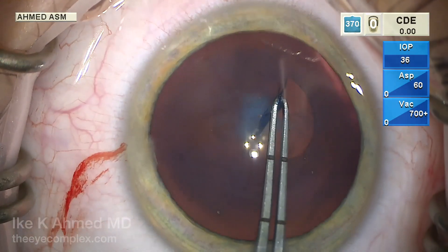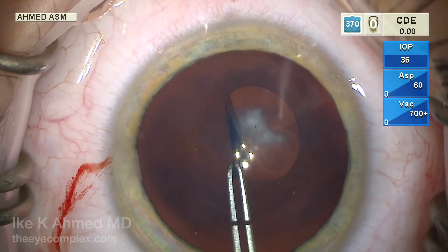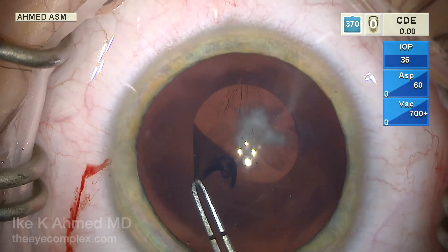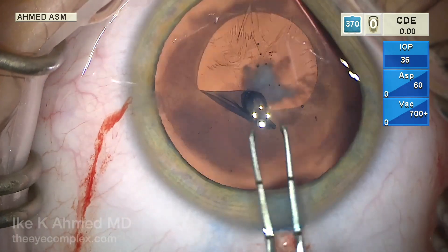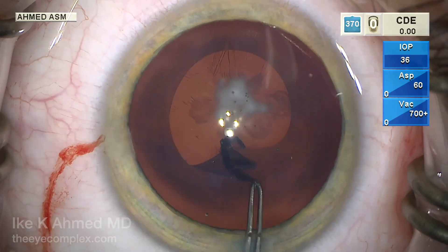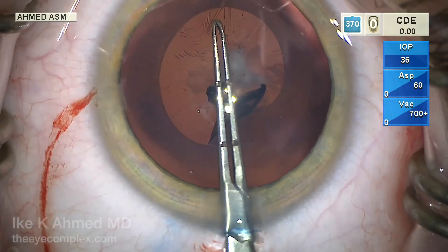We note the elasticity of the capsule — the vector forces are quite different than in an adult eye. As you can see, we're basically turning and pointing almost to the center of the lens to propagate this tear in a curvilinear fashion. The use of trypan blue does seem to help, and the super viscous Helon V has flattened the anterior capsule to reduce the risk of running out, very carefully using a shearing technique.